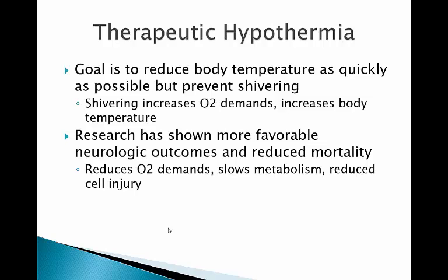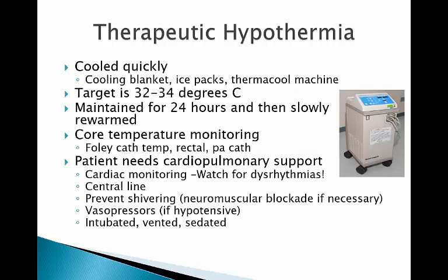We usually have something called BIS monitoring, which is neurological monitoring. We can monitor their brain activity, basically, if you will, to see how awake they are underneath all of this medication that we're giving them. Now, in addition to receiving all of the things I just said, they're also probably on vasopressors and IV fluids, and we're monitoring all kinds of things about them, keeping track of cardiac output and their status while they're recovering. Or while we're attempting to have them recover, maybe that's better.